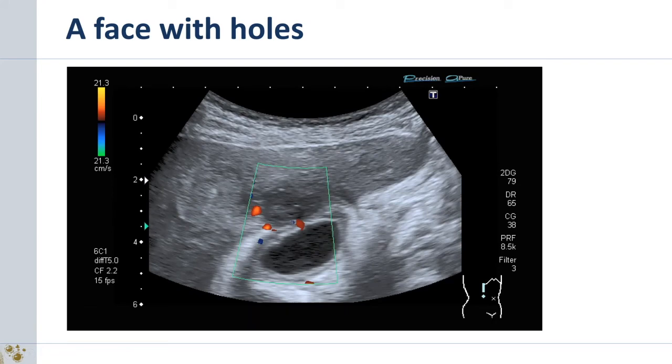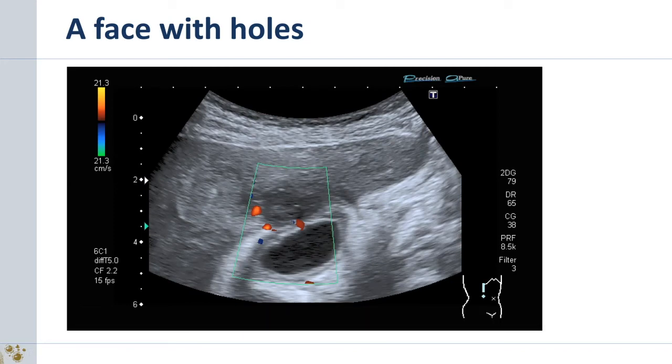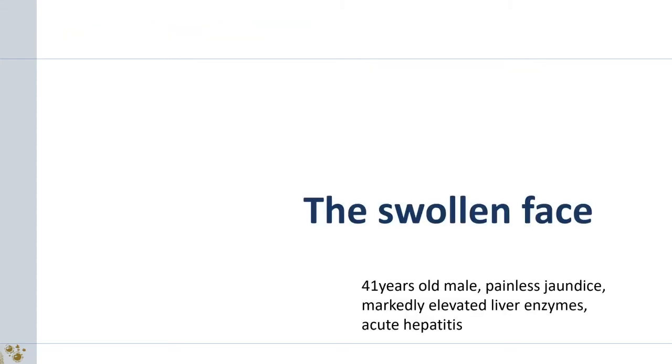I will not show you, but you can use artifacts, like in this case an artifact. It is an induced flow of pus, in this case between two cavities, to help you to establish a diagnosis.